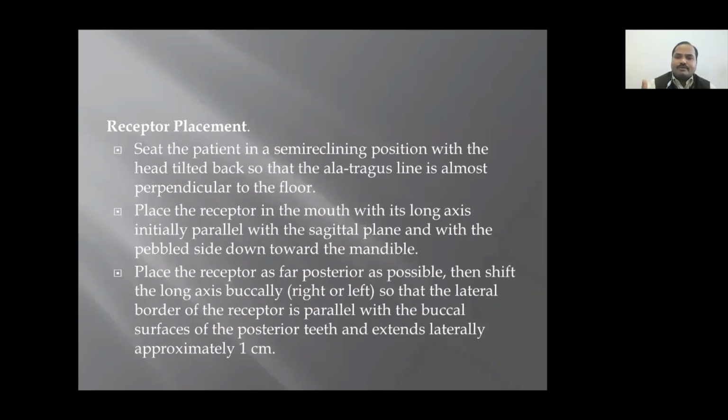Like in the true occlusal, we used to extend it 1 centimeter beyond the central incisors.